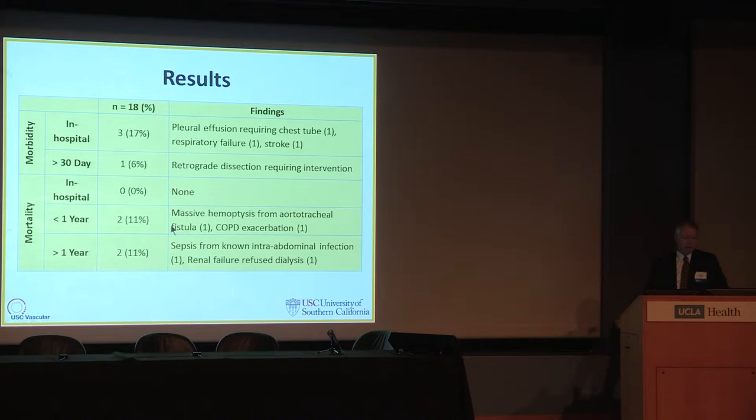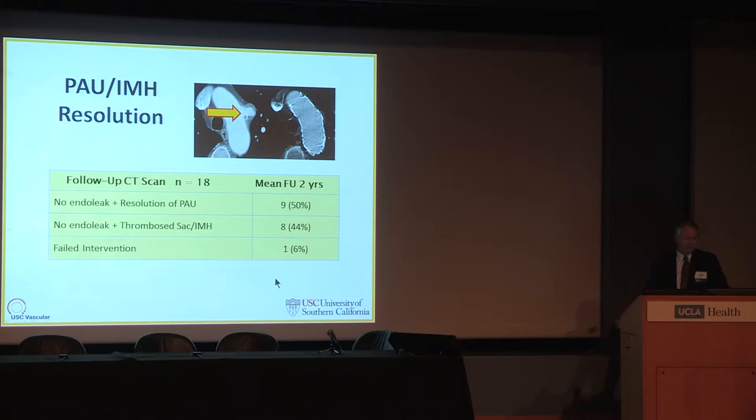At follow-up, we had one patient who died from massive hemoptysis and an aorta-tracheal fistula. Other reasons for mortality were not related to the penetrating ulcer but are really part of the patient population that develops a penetrating ulcer. TEVAR was quite effective in treating these ulcers, with resolution of the ulcer as well as the surrounding hematoma.